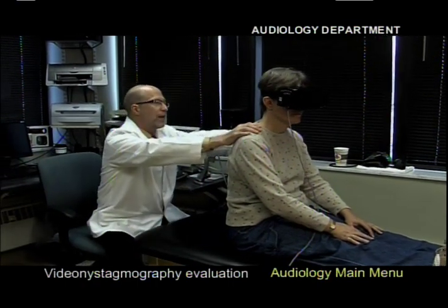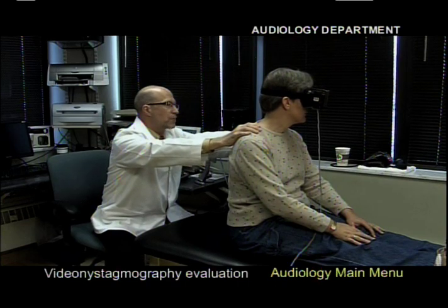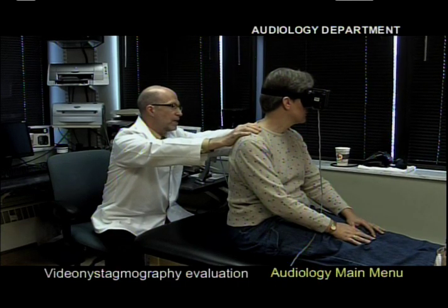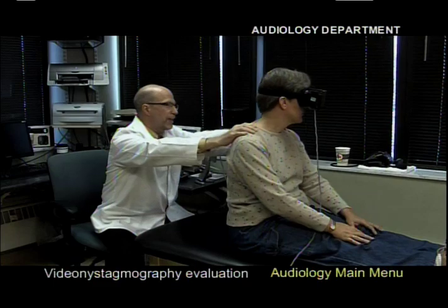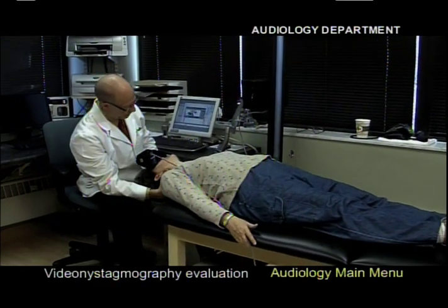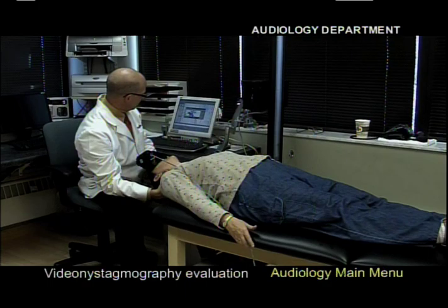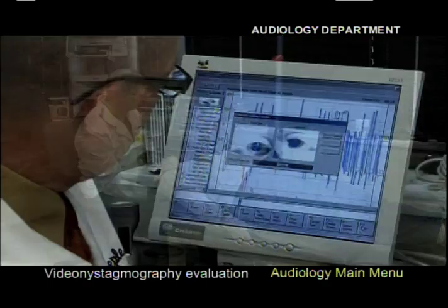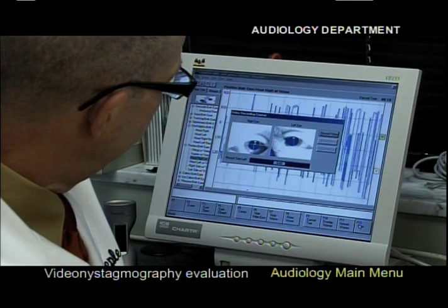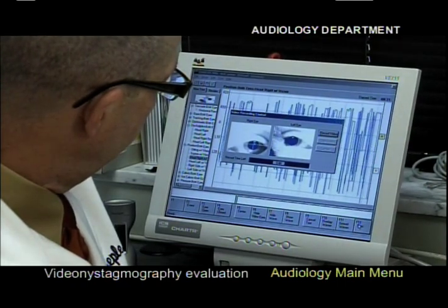Positional testing involves moving the patient through a variety of head and body positions on an examination table while monitoring eye movements with the infrared goggles. This process can help identify positional vertigo or BPPV and other types of position-provoked dizziness, such as cervical vertigo or central positioning vertigo.